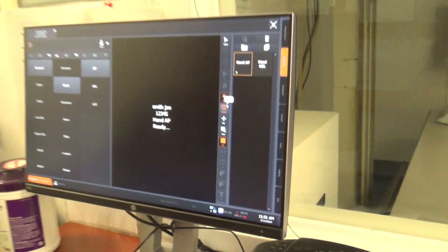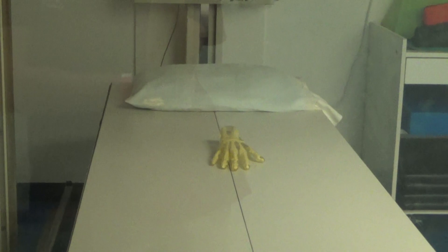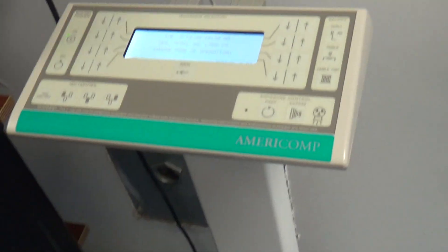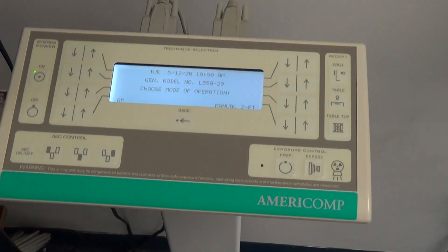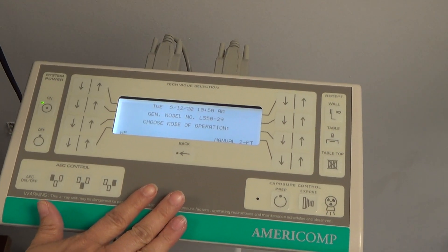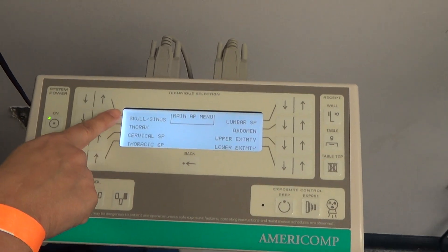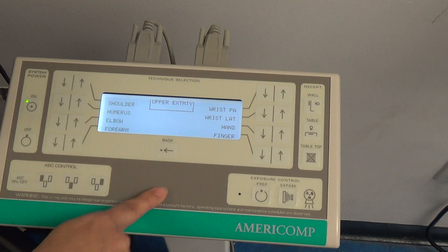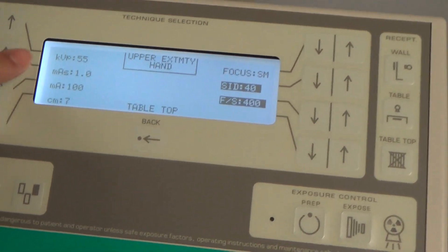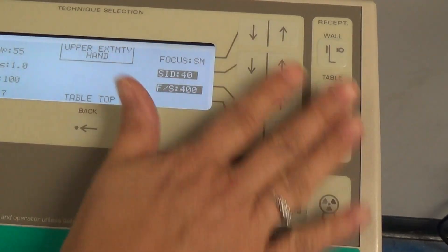This is why it's important to make sure that you've picked your body part — because it will actually go ahead and prompt you for a hand in the AP position, which our patient is in. To take an AP projection. So on this, you have an anatomically programmed machine. This actually prevents you from having to have that technique chart in your office. You actually put all that information into this machine. My technical factors — KVP, MAS, thickness of body part in centimeters, distance, focal spot size — all that is already programmed into this machine.